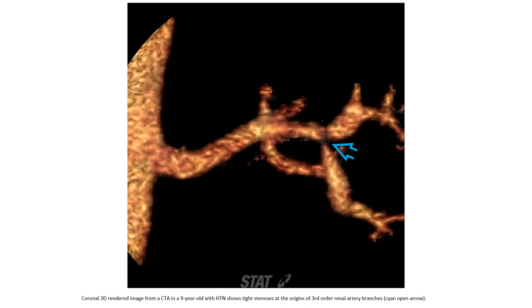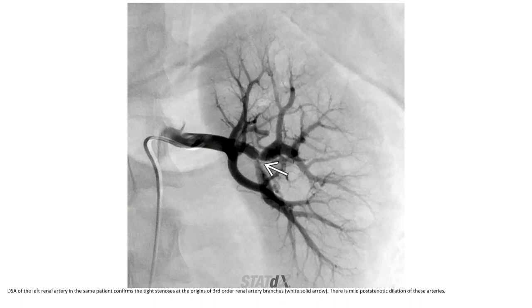Coronal CTA surface rendering of a CT in a 9-year-old with hypertension shows tight stenosis at the origin of a third-order renal arterial branch. DSA of the left renal artery in the same patient confirms the tight stenosis at the origin of the third-order renal artery branch, with mild post-stenotic dilatation.